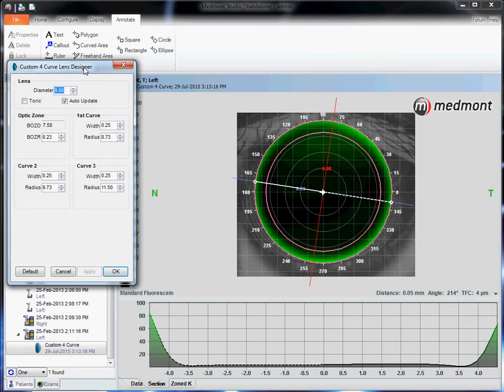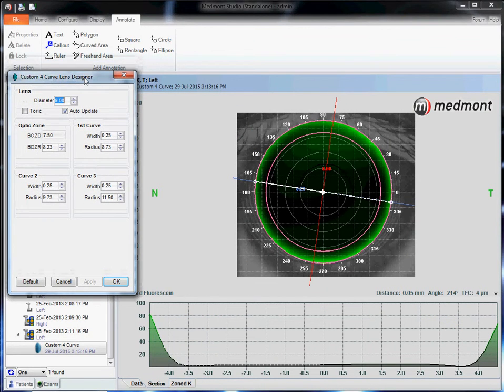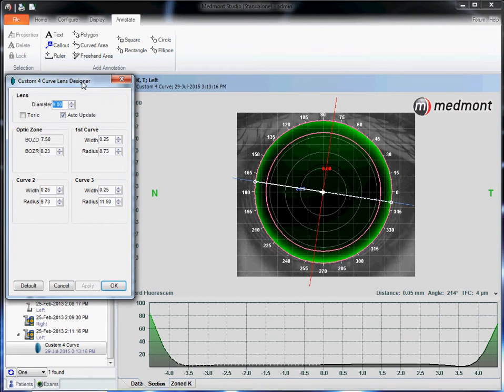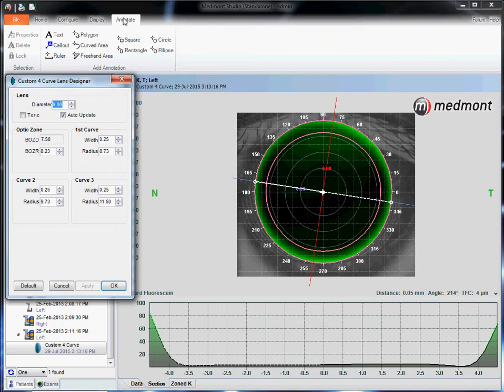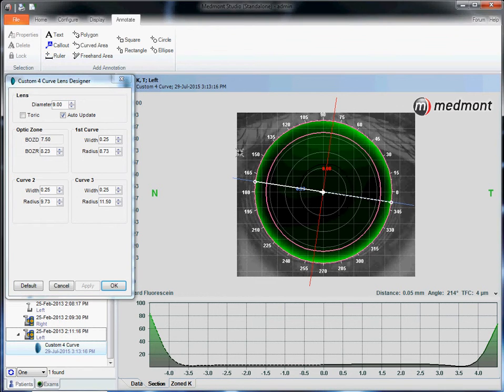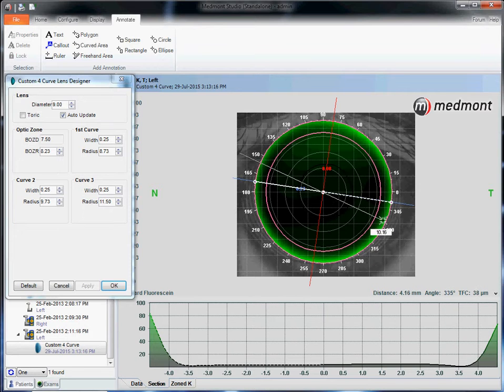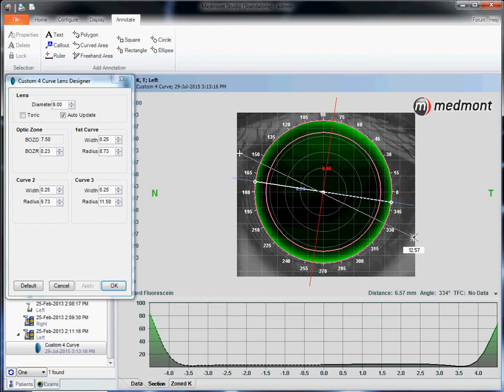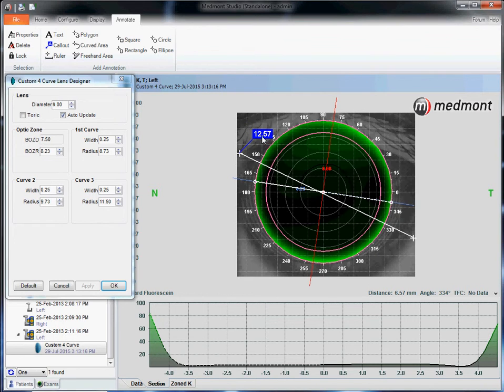That brings up the design window. The first step is to determine the right lens diameter. Measure the visible iris diameter by going to annotate. One of the ruler options is to select the ruler. Drag it from one side of the cornea to the other. We see this is a 12.5 visible iris.